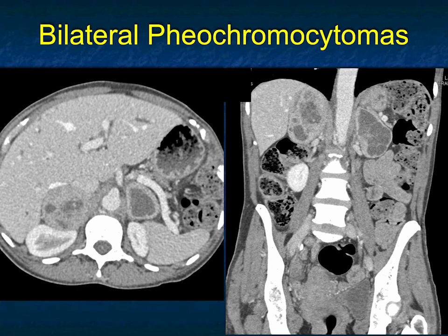I love this case because it gives you a differential of bilateral adrenal masses, it gives you a differential of cystic masses, and also emphasizes the history of syndromes. You've got to know what's going on with your patient.